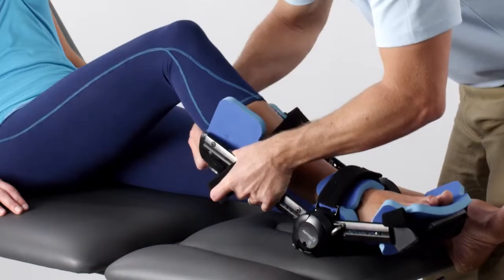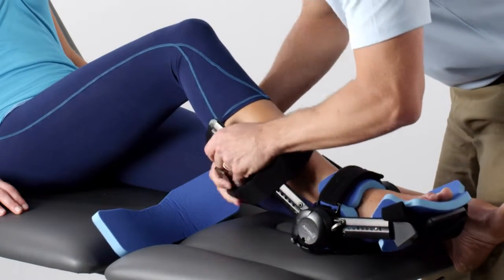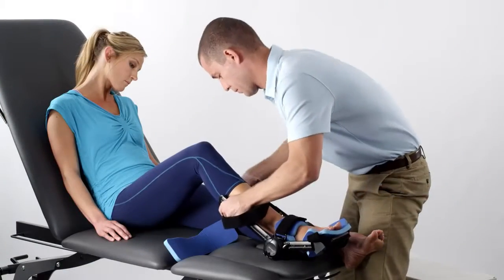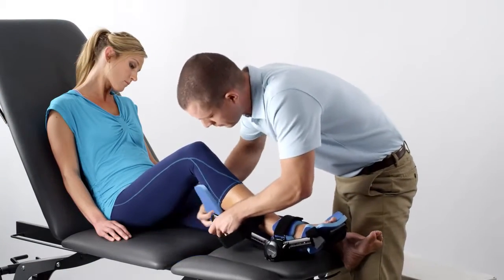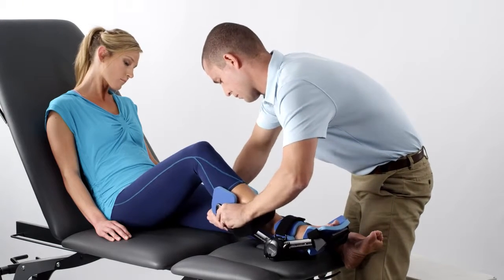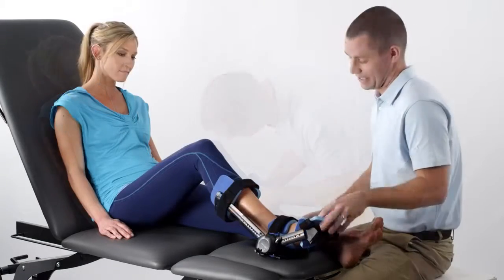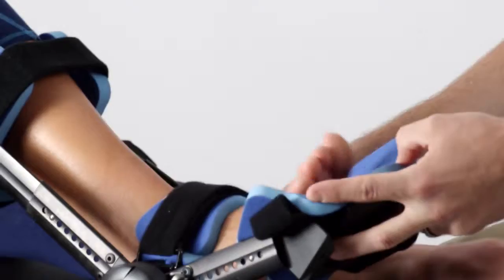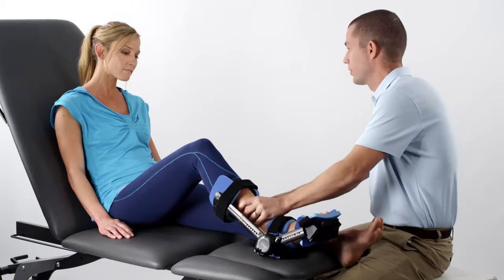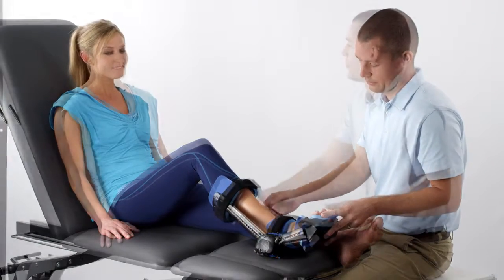To achieve the best fit, remove the foam pad from the contour cuff and gradually overlap, bend, and shape it for a snug, comfortable fit. Then re-secure the foam pad. When the device is secure, check for any neurological or vascular changes. The patient should not experience any numbness or tingling while wearing the orthosis.